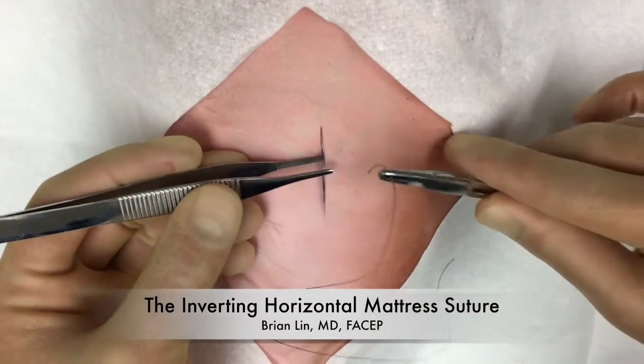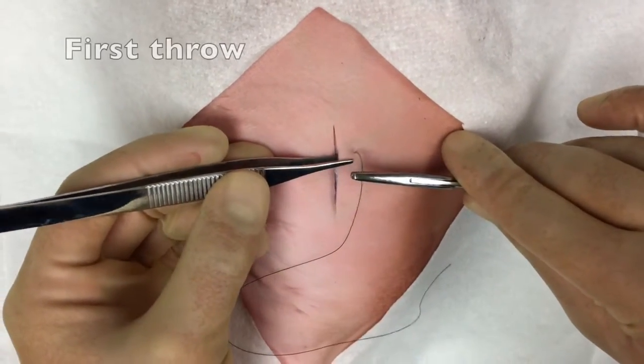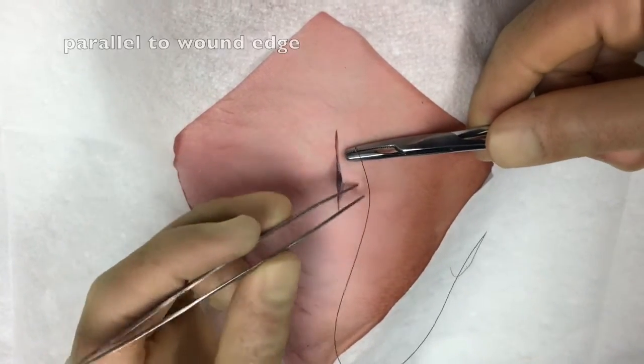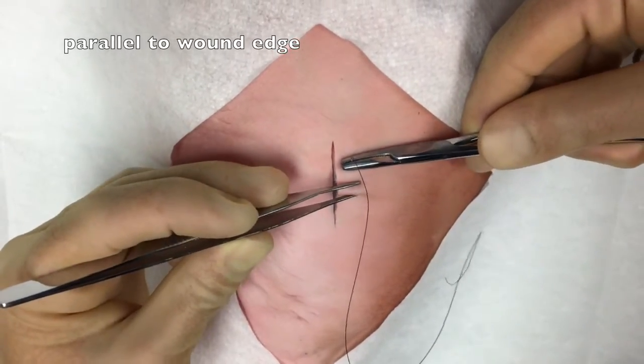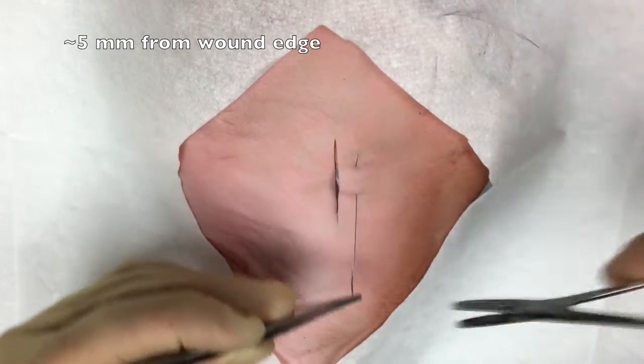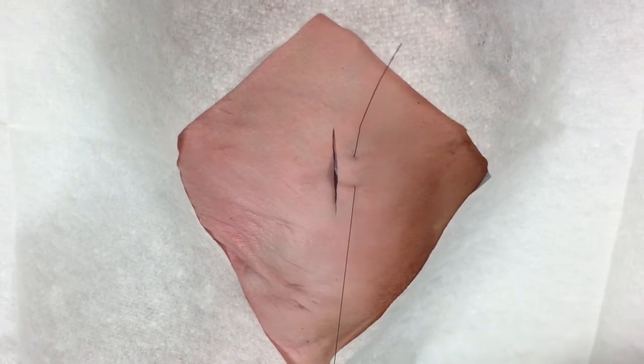This video is a demonstration of the inverting horizontal mattress suture. To begin placement of this suture, the needle is first passed parallel to the wound edge, passing through the tissues and exiting again on the same side of the wound edge.